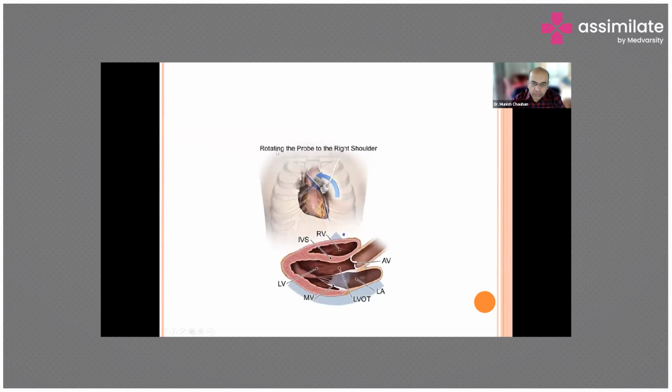So this is how we are cutting. This is the right shoulder. This is the probe pointer. Cutting it right here, if you open it up, this is what you see, superior to the apical part. From anterior to posterior, this is the right ventricle. Remember the probe is here, over the chest wall.